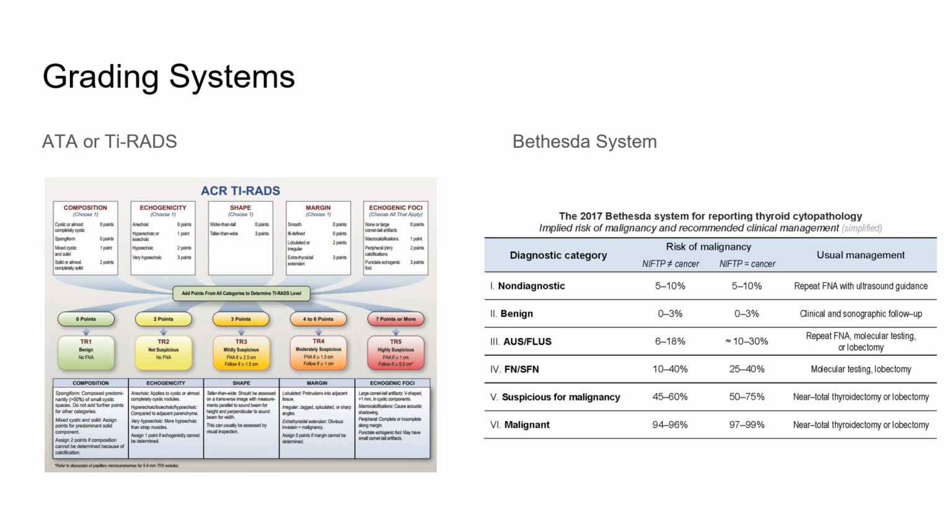As far as cytology is then concerned, there is the Bethesda system, and I have a picture that they include in one of their papers here. Later on, I'm going to show you another one that I have put together from two different papers that I feel is a lot more helpful because it includes more of the information that they discuss in their report. But suffice to say, you get diagnostic categories based on what you're seeing under the microscope, and it tells you a lot of information, including how concerning this is for malignancy, so you can communicate that to the patient, and how this should be managed from here on out.